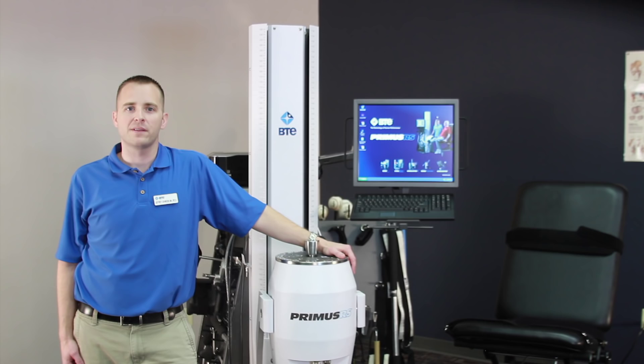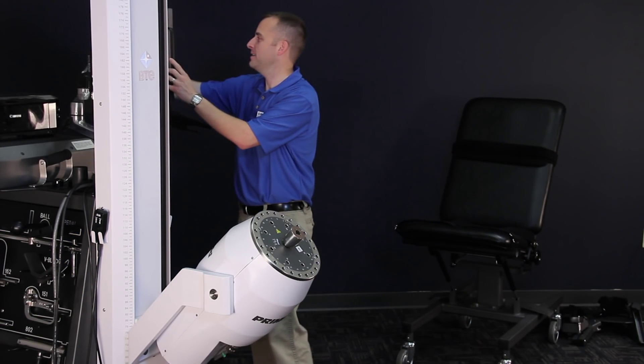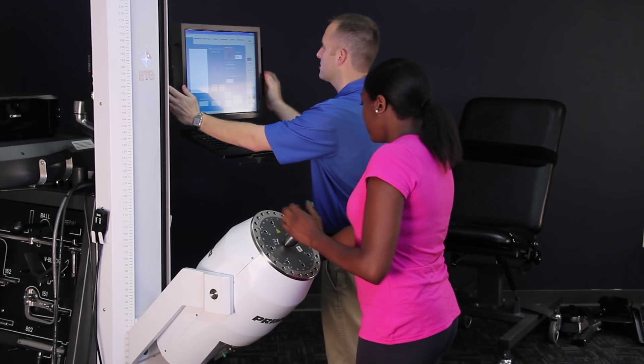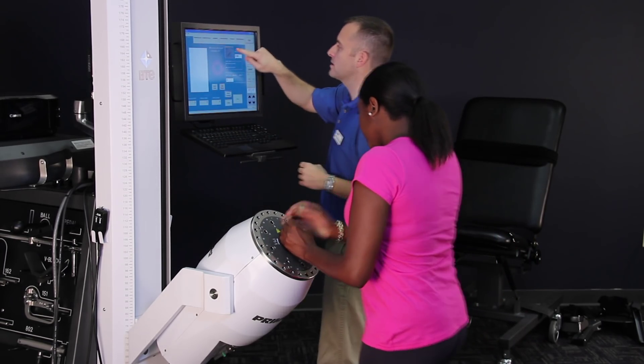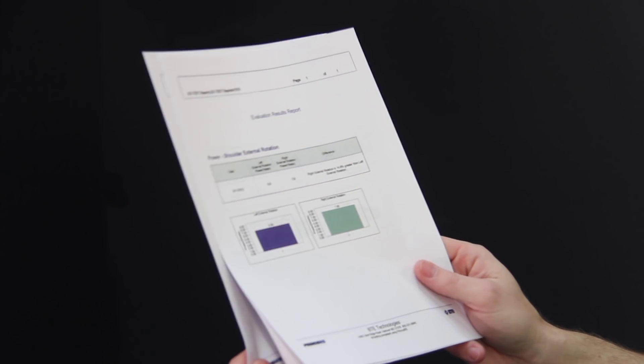Primus was designed with you and your patients in mind. Its swing arm control touch screen is easily moved to either side of the system for maximum flexibility in treating patients. Print evaluation, treatment, and progress reports right from the machine.